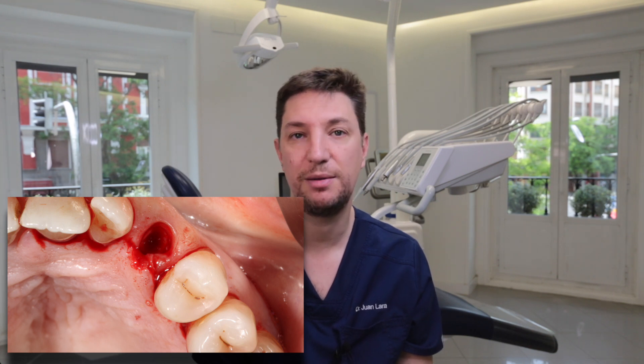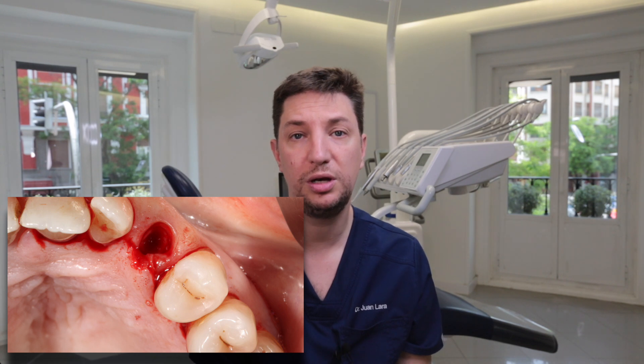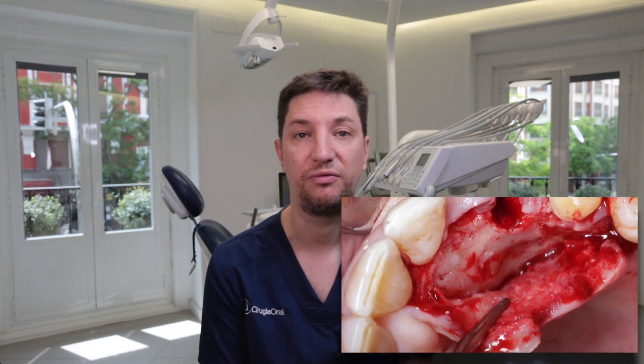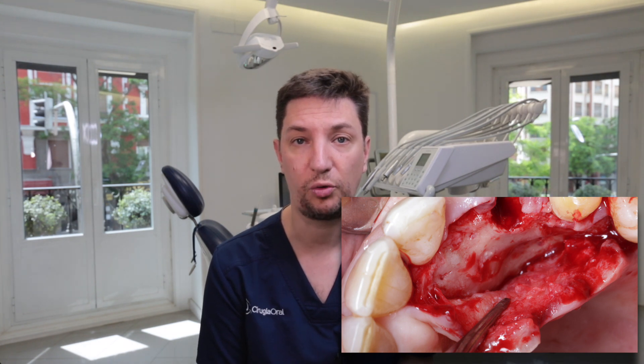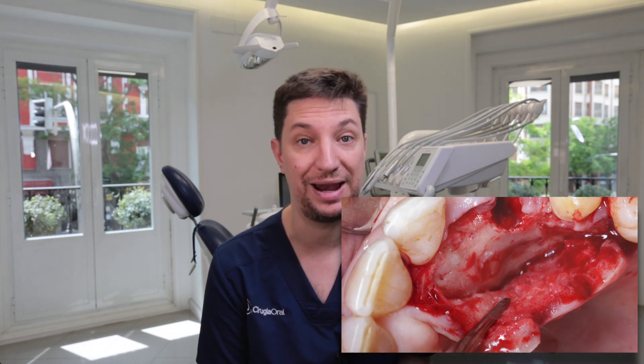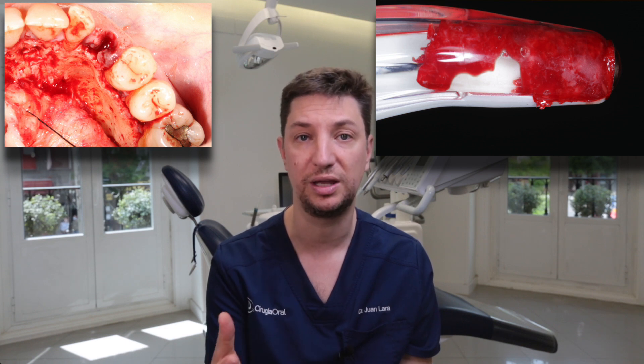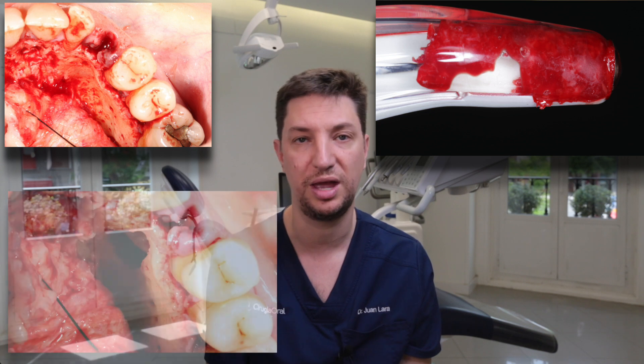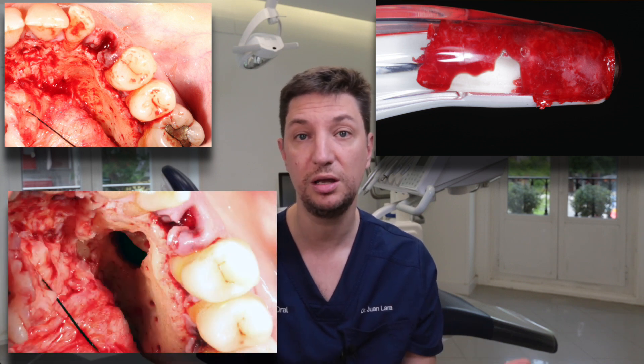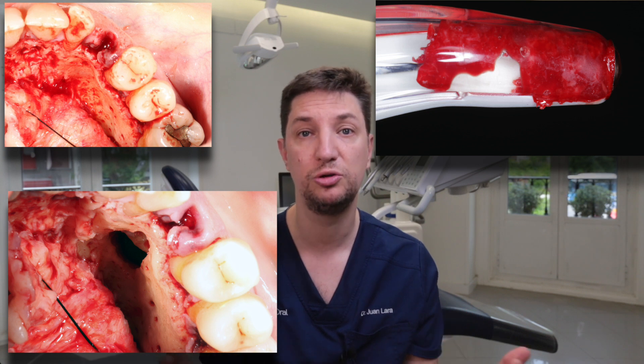The surgical approach is the same as if we were only removing an impacted canine. Since this tooth is usually located on the palatal side, we perform an intrasulcular incision, raise a mucoperiosteal palatal flap, and then — instead of immediately doing the osteotomy with a bur — we use a safe scraper. We scrape the bone and harvest it, and when we reach the crown of the canine, we continue with a diamond bur or a tooth sectioning bur. This way, we save a lot of bone that we will use afterwards.